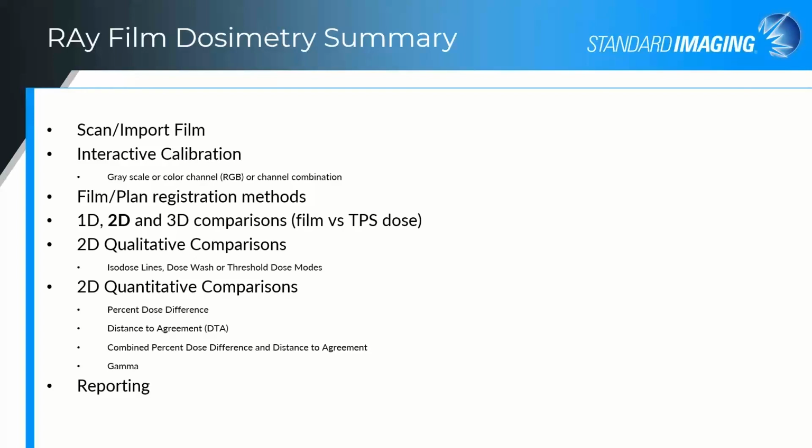And so in summary, these bullet items show the basic workflow of the Ray film dosimetry software.